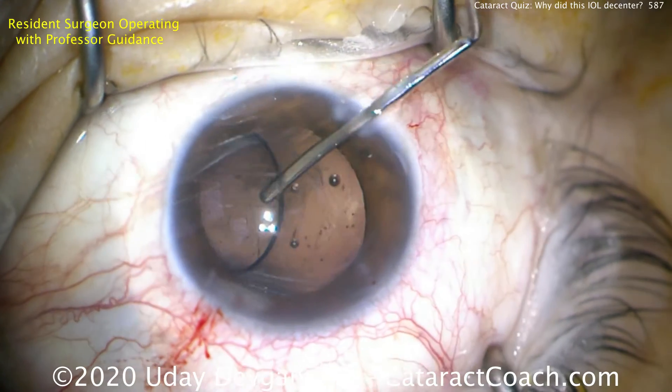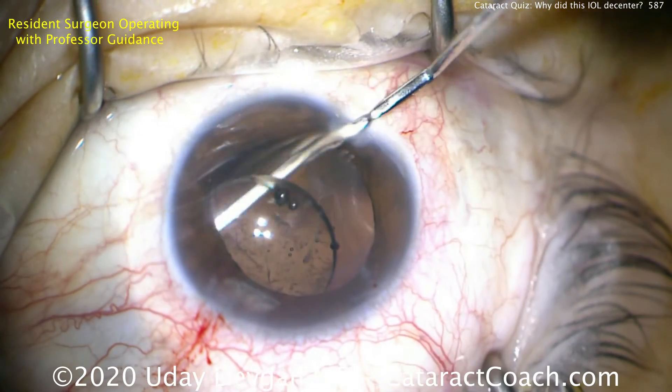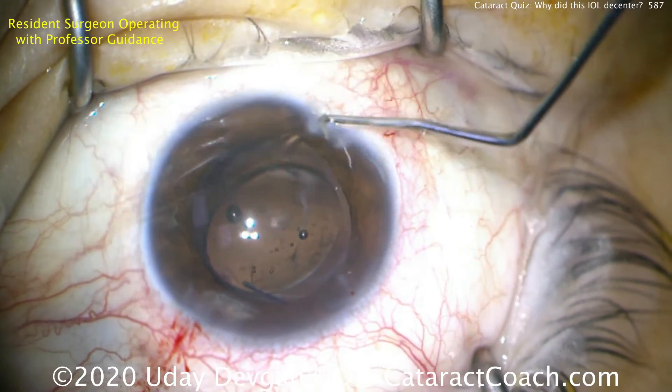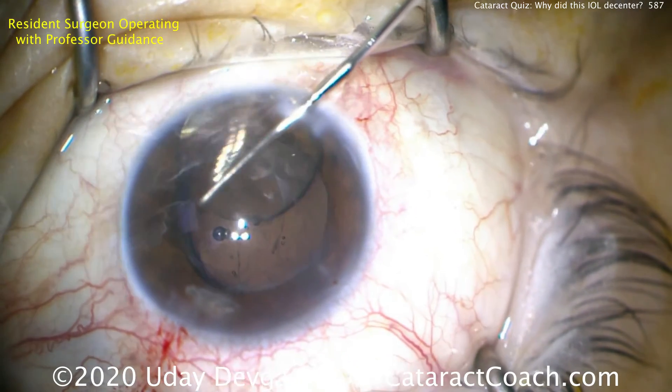We definitely need this capsule in order to support the replacement lens. So once we get the lens dialed up here out of the capsular bag, I think you can see the answer — there's only one haptic.